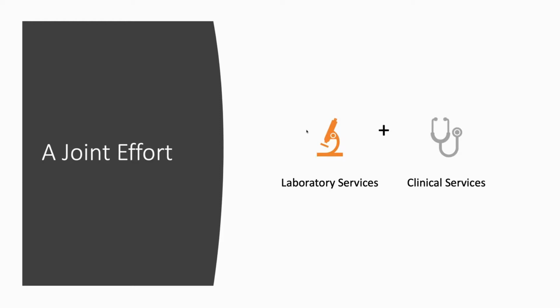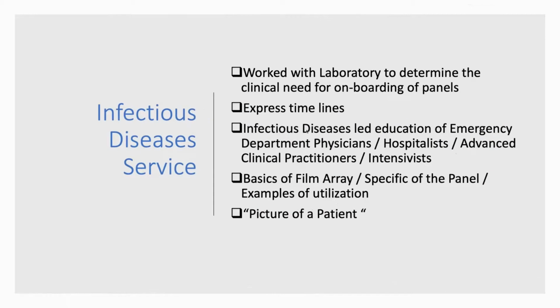So what we sat down and we did was we developed an implementation plan, right? Arpad and his crew were going to set up the BioFire. They were going to run all the tests that they need to run. They're going to bring it online, right? And we're going to set up a go live date.